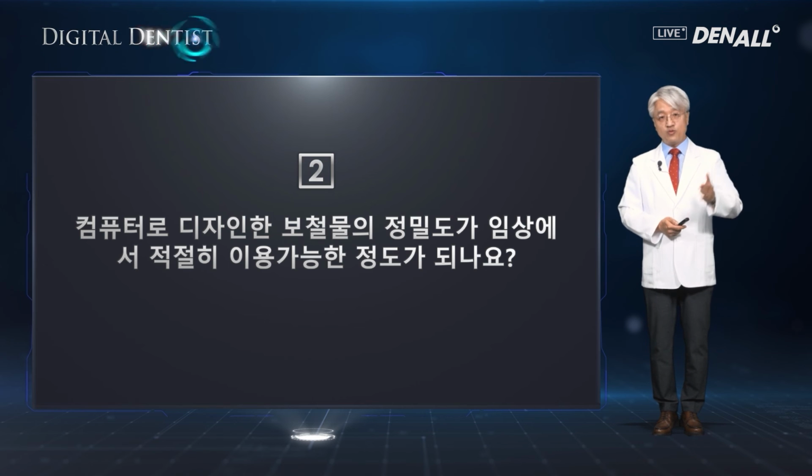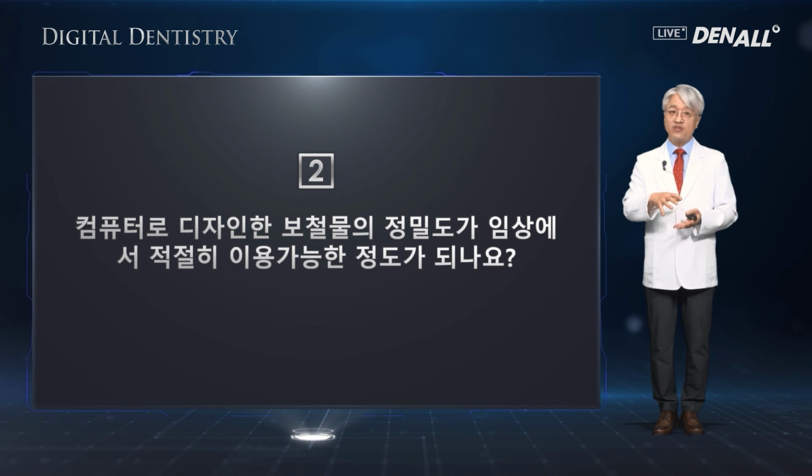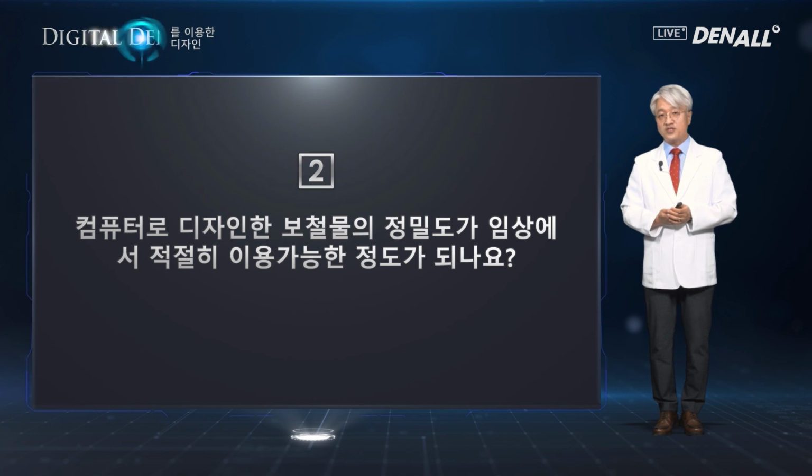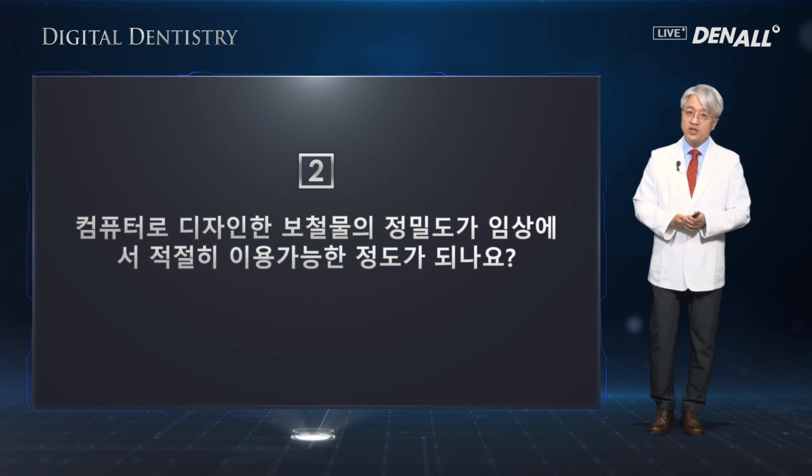However, based on my 5 to 6 years of experience in this area, errors are made in a lab if you use a conventional approach in an external lab during taking rubber impression, stone pouring, model making, or pin work. Also at a lab, if it goes through many technicians, errors are added. Compared to it, if you use CAD software for designing, errors are limited to an intraoral scanner or milling machine.